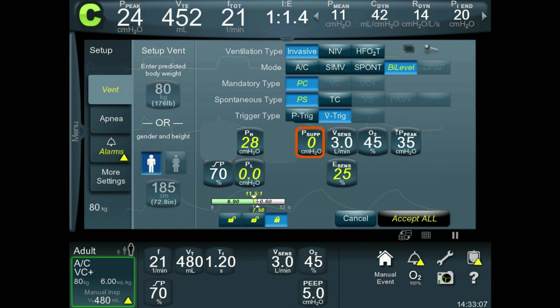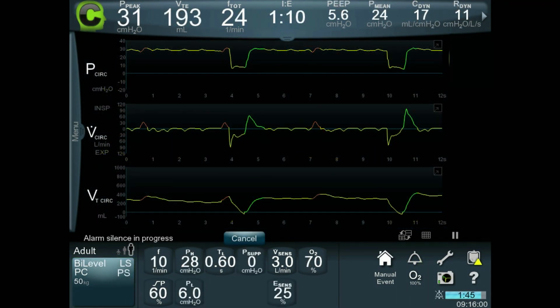If you're putting a patient obviously on pressure support, you usually have an expiratory sensitivity. And even on this particular ventilator, pressure support of 0 really corresponds to 1.5 centimeters of water of pressure support. So just be aware of that. And that's another reason for keeping that P high lower than 30. So imagine that I've instructed you to put this patient on airway pressure release ventilation. I go off and I come back, and the first thing I say is, you have made a mess of this. Pause the video now and see what's wrong with this picture.